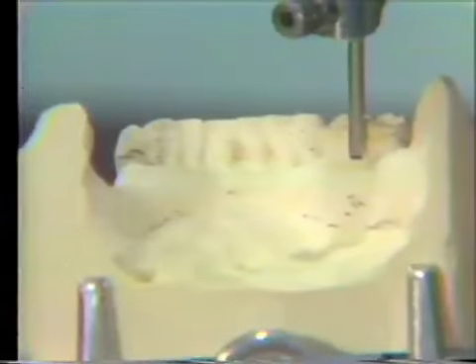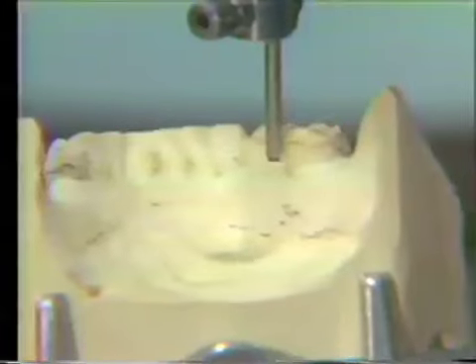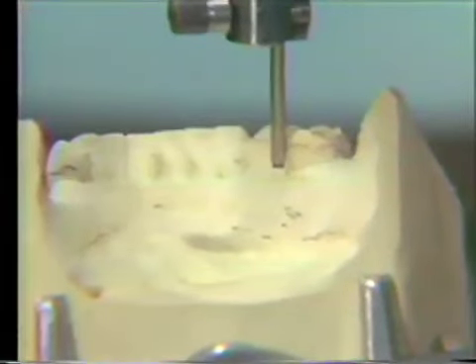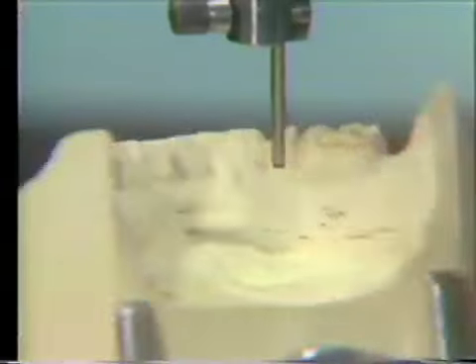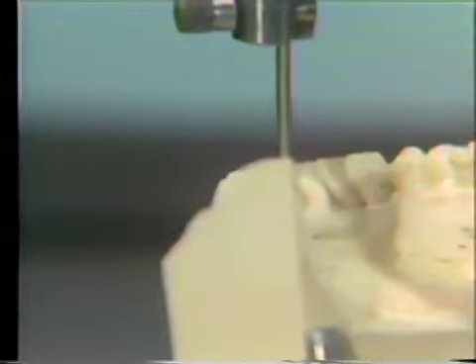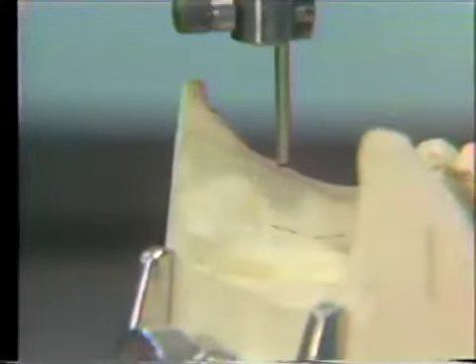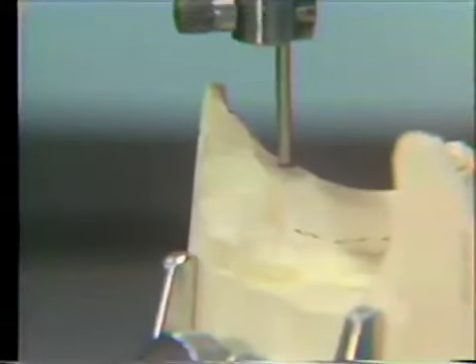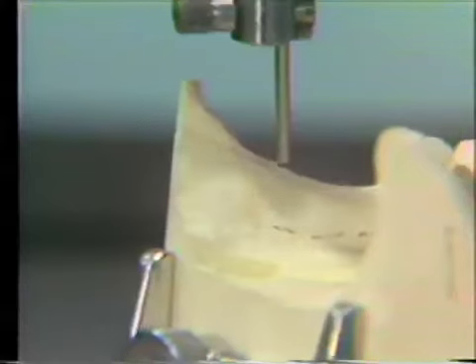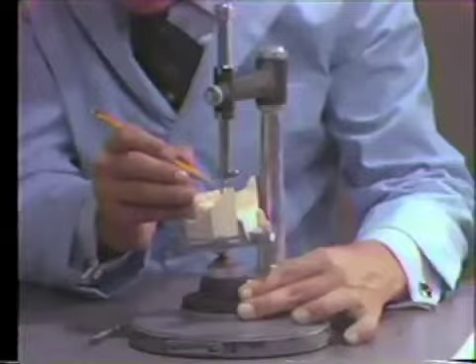And it looks as if I use that, I could probably use the junction of this molar tooth with the gingiva as another plane. Let's just double check. That just came down a little bit. Okay, I'll use the incisal edge there. As I go back to this side, I can probably touch it and mark a spot here on that crease, which would be a crease in soft tissue, which would be reproducible. So let's start to mark those 2 points. Okay, I put a mark there.